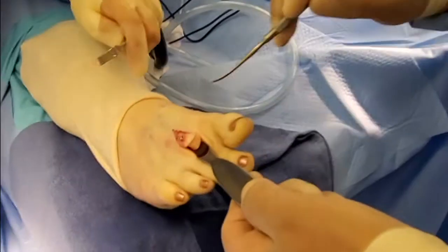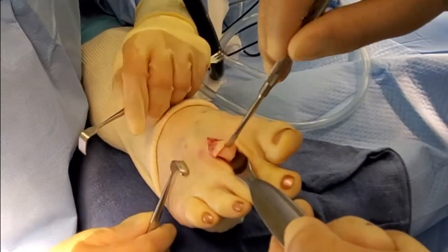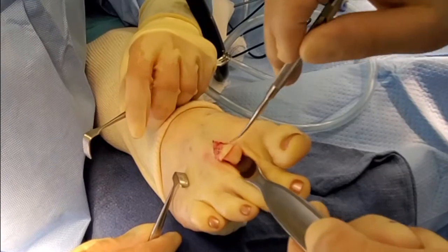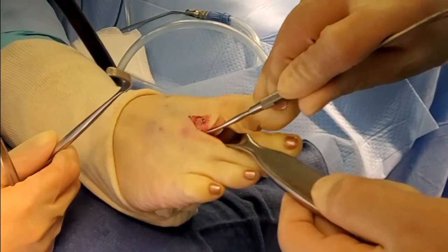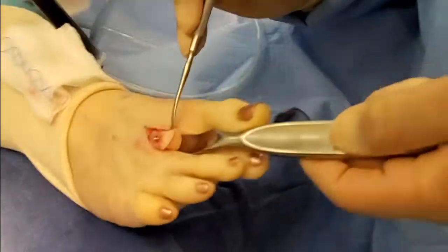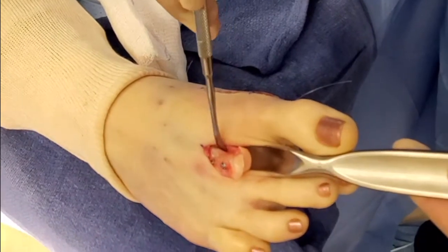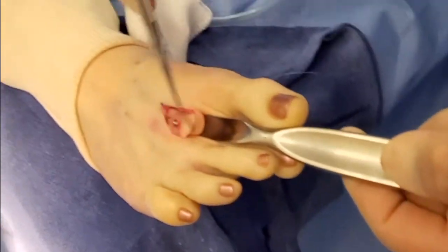As you can see, looking underneath here, the bone has been shifted over to the right and slightly back in attempts to reposition it. You can see how it shifted over — this shelf is sticking out over there and this top part over here is sticking out, but this part right here isn't sticking out after we shift it over.